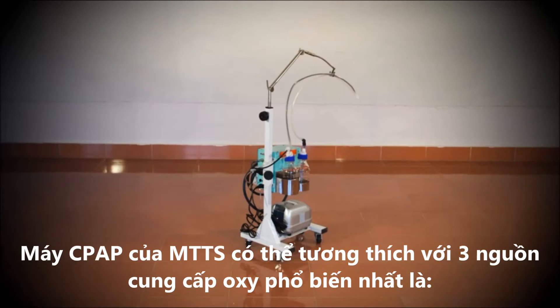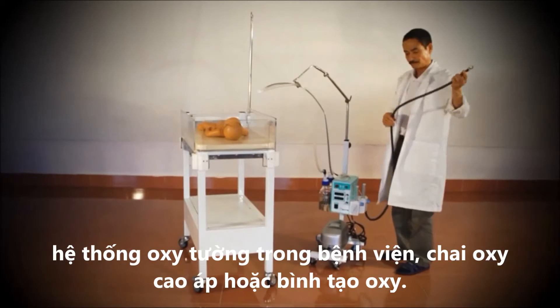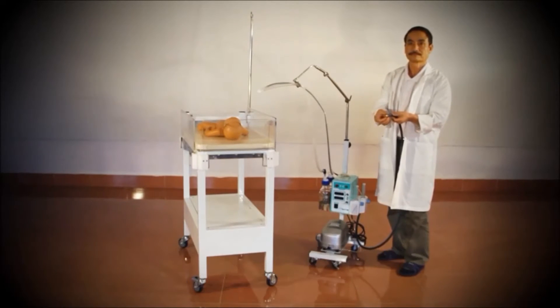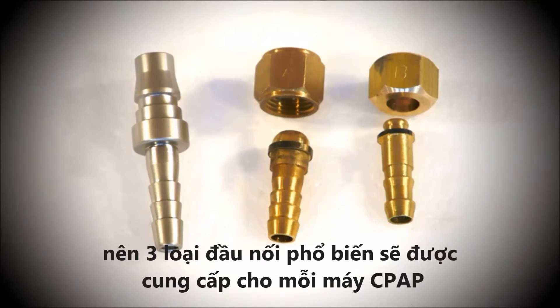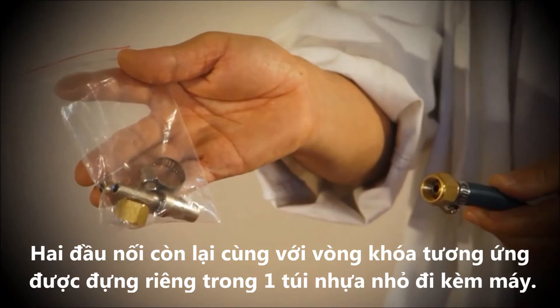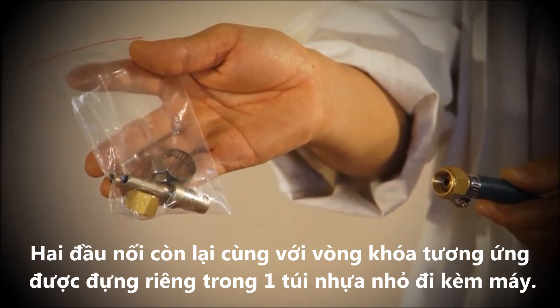The MTTS CPAP can be connected to the three most common oxygen sources: hospital walled gas system, oxygen cylinder, or oxygen concentrator. Because different systems require different connectors, three common types of connectors are included with each CPAP machine. The most common connector comes attached directly to the oxygen hose. The other two can be found in the plastic bag along with the ring clamp for securing them to the hose.